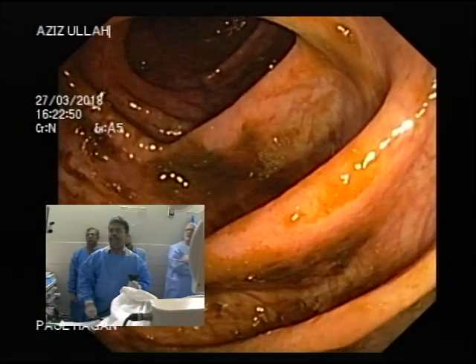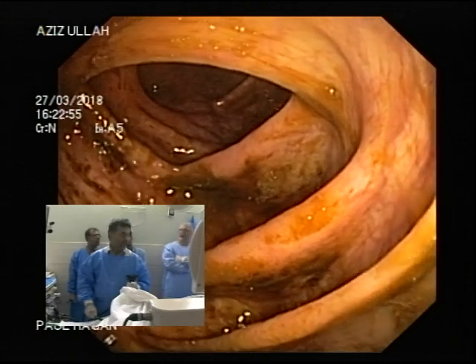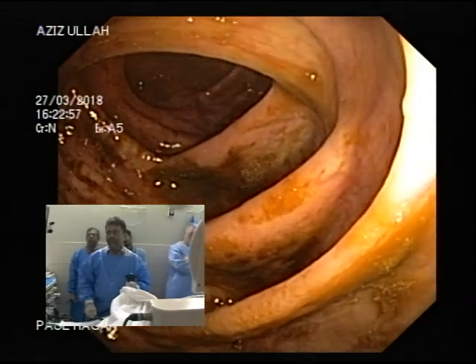Okay. Might as well just take the tube out, my boss, and we'll take the biopsies in the sigmoid. Yeah, we need to take biopsies on the sigmoid. But have a good look on the way back.